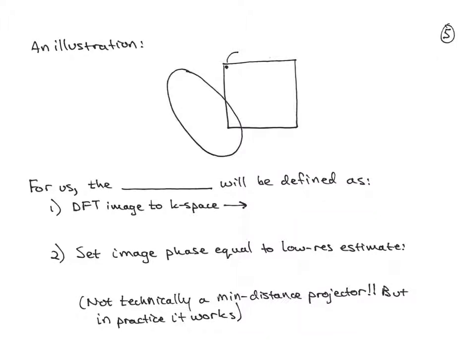So here's an illustration of this. If we have this initial point in one set here, set 2 here, we're going to project that in the first iteration over to set 1. So this will be using P1 of that point, P1 of x. Then we're going to project that to the closest point in set 2. Now note, importantly, that this is a different point, right?